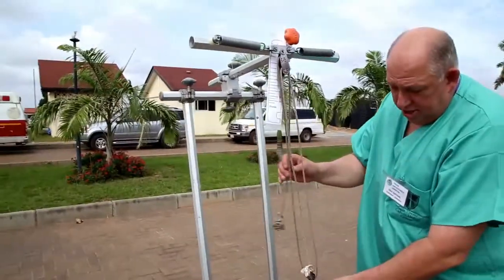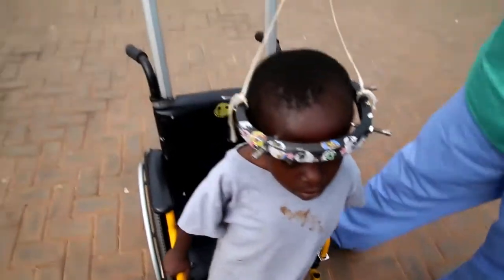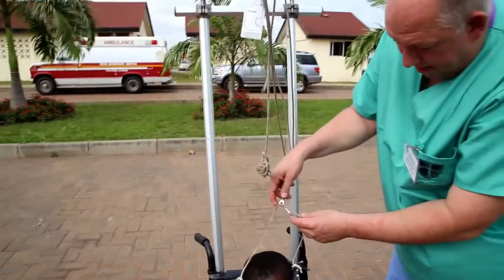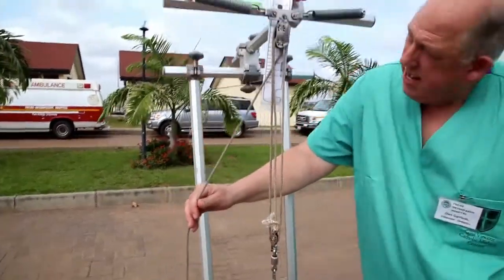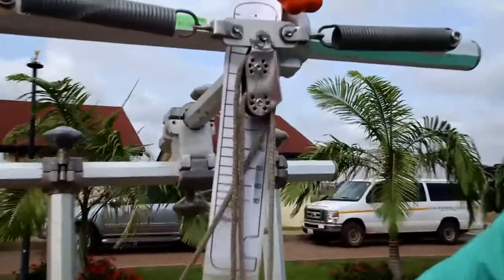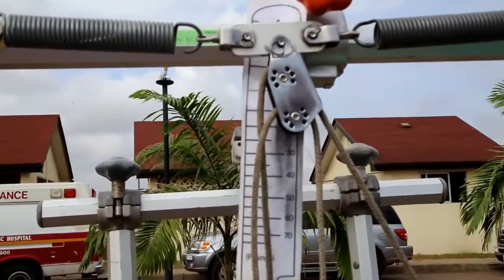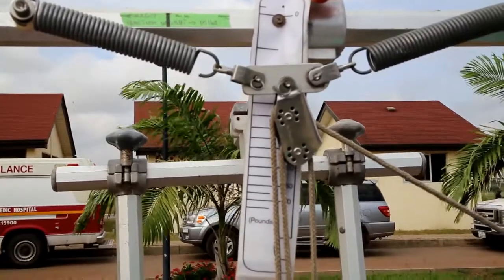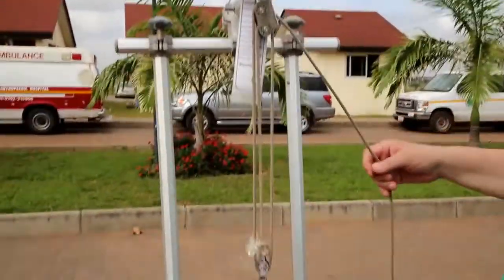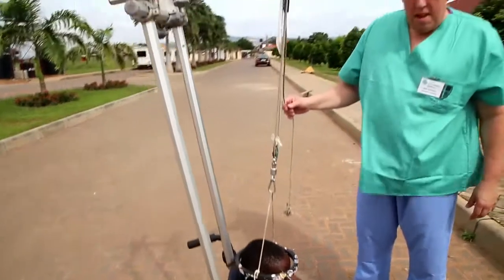We loosen the traction system, have the patient sit in the chair, get him comfortable, hook up the traction system, and pull the string to tighten it. Right now there is zero pounds of lift on the patient. We want to put ten pounds of traction on him, so I pull the string down and load it at ten pounds, then lock it in place. Now he is sitting in the chair with ten pounds of load on the traction system.